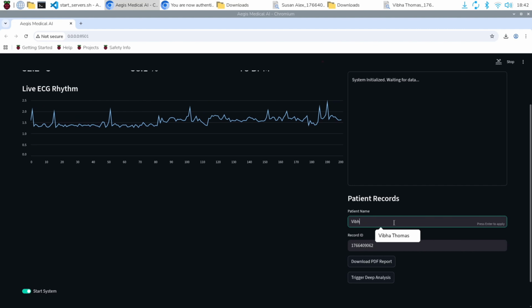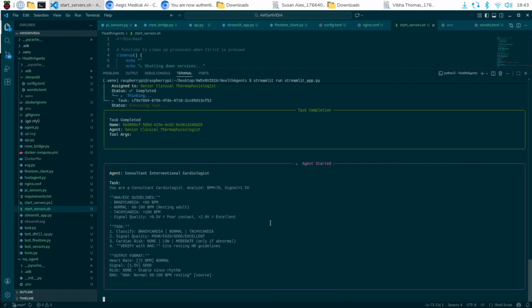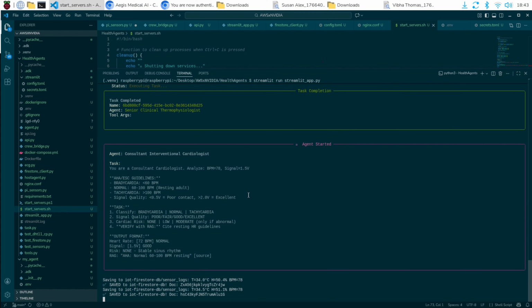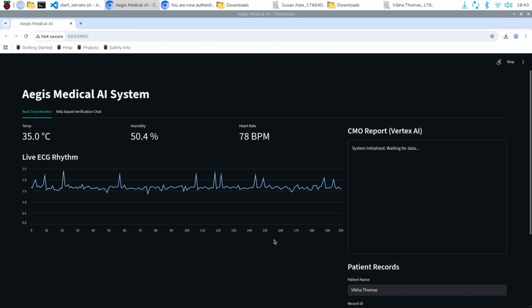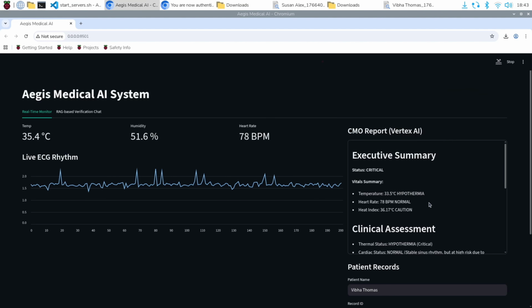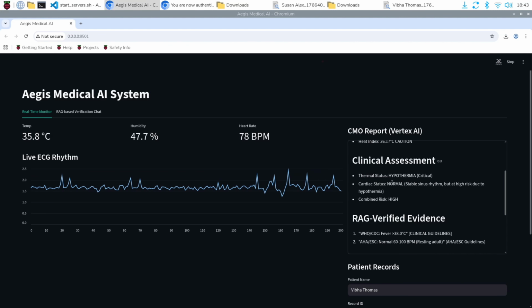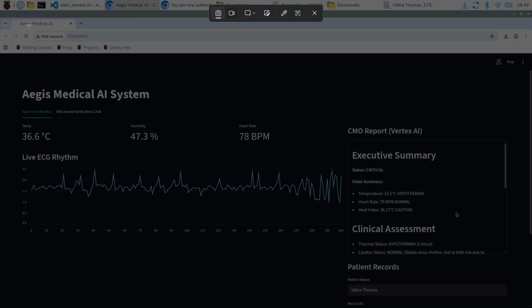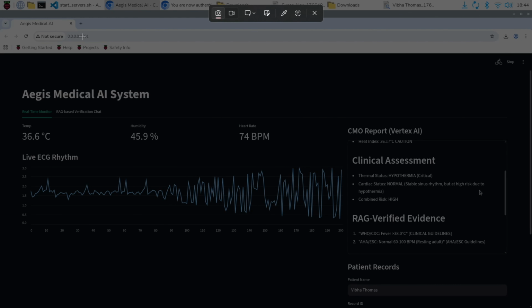So here I'm just going to enter the patient's name, that's me, and let's trigger a local analysis. This is for hypothermia, which is at 33 degrees, when the normal body temperature is usually between 36.5 and 37.5. So here you can see my agent is running locally, and I'm trying to increase the temperature of my DHT sensor using my light. Now you can see there's a report that has come from my agent which shows hypothermia and normal heart rate, and this is local, it does not use any other inference. So let's just take a screenshot of how beautiful the report has come out.